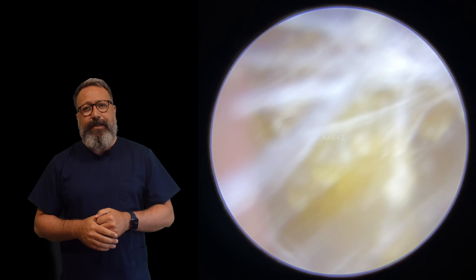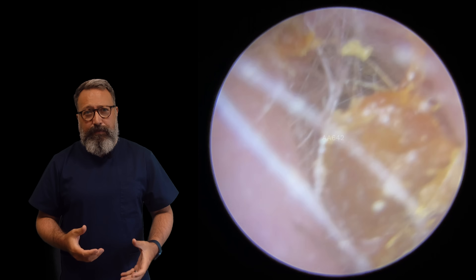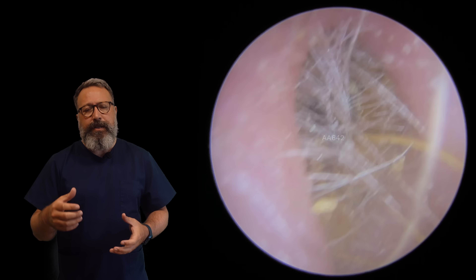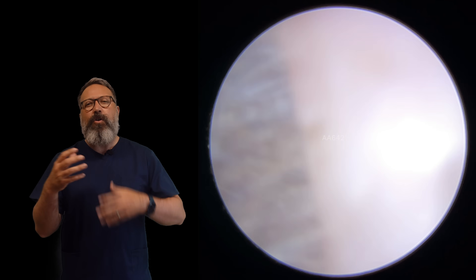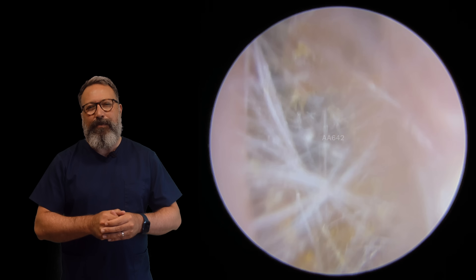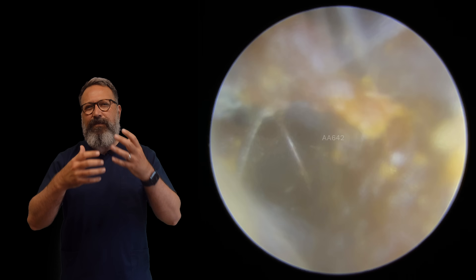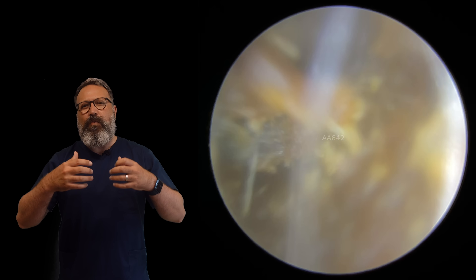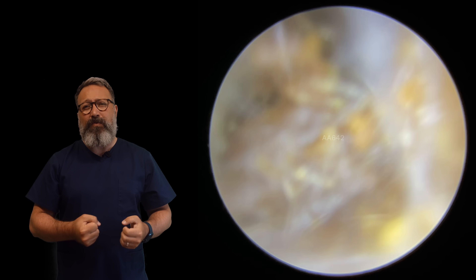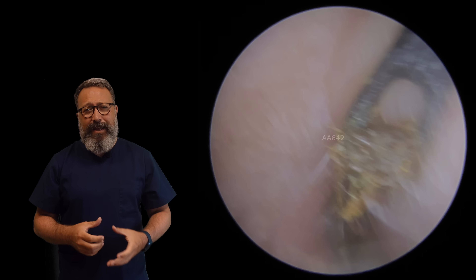This poor gentleman has loads of difficulties with his hearing. He's had his ears irrigated before and had real difficulty getting his ears nice and clear — they've always left something behind. So what we've got here is a combination of different factors all working against us. We've managed to break down the first little bit of wax, but there's quite a density around the outside part of the ear canal which hinders the view slightly. The wax is really, really solid, and the entrance to the canal is a little bit narrower.